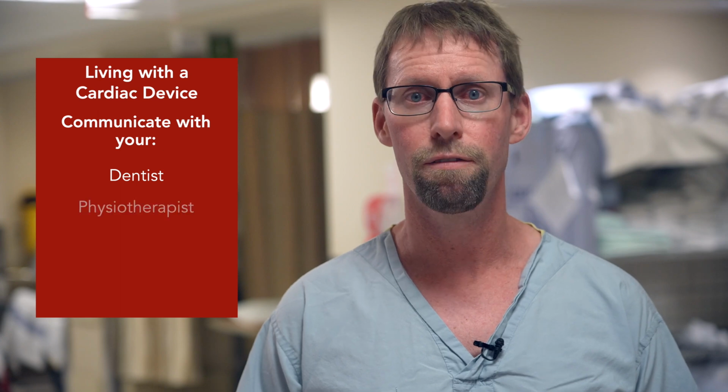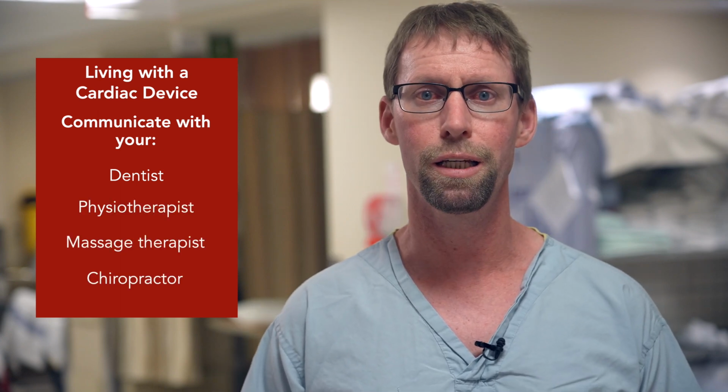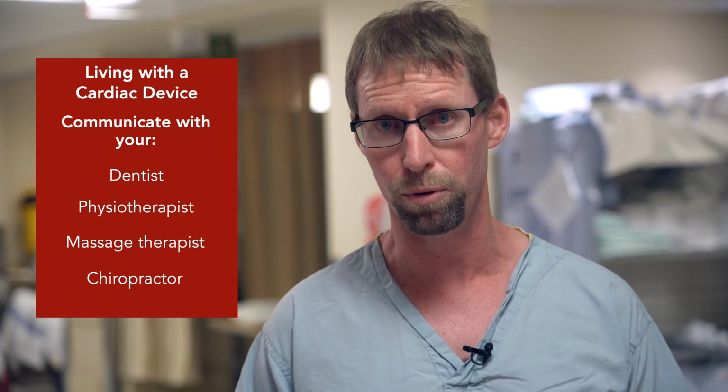Always tell your dentist, physiotherapist, massage therapist, and chiropractor that you have a pacemaker. They might need to take special precautions before starting certain medical procedures or therapies. We hope you have a smooth and restful recovery from your cardiac implanted device.